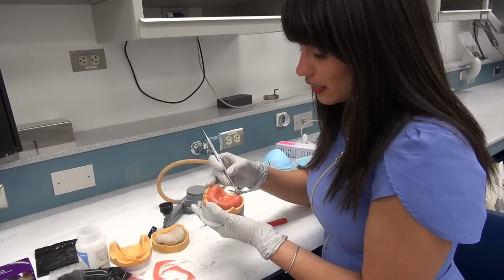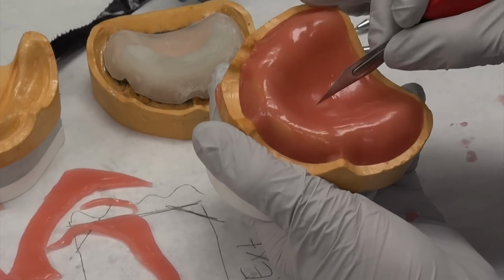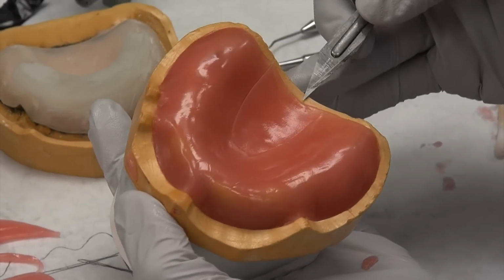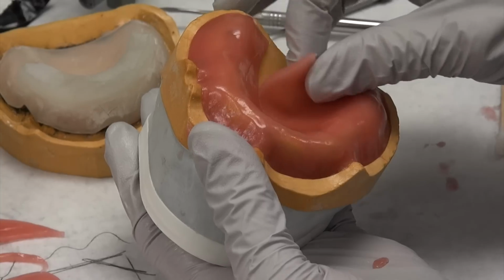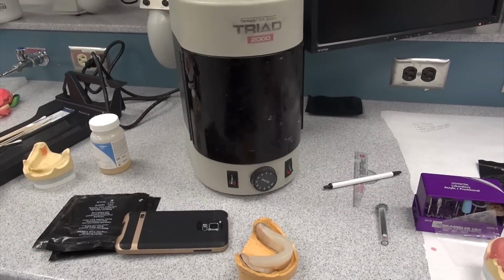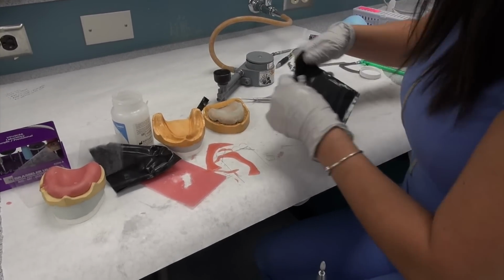With your number 7 spatula, you can rub the posterior border of the palate and smoothen that up. Next, you can cut out a small area, horseshoe shape. This will essentially allow any polymerization shrinkage of the palate to be minimized because you've removed it and cured. Now this little piece here, you want to cover it so it doesn't start to set, and during that time we're going to move to the mandibular.